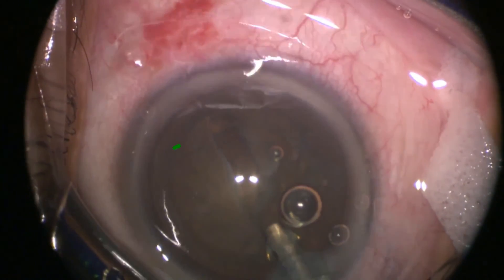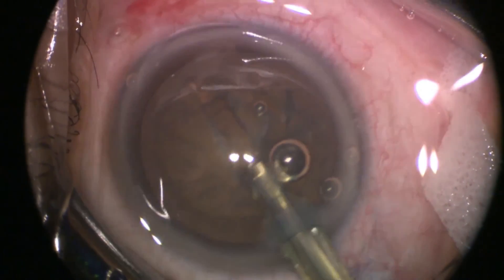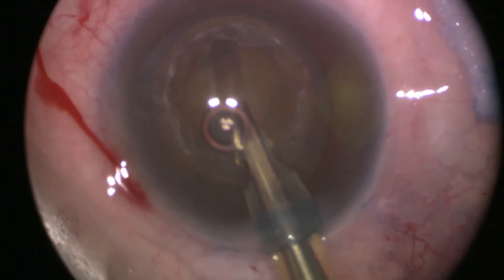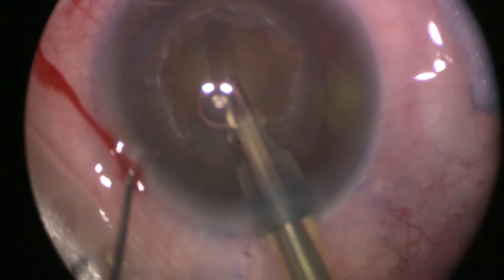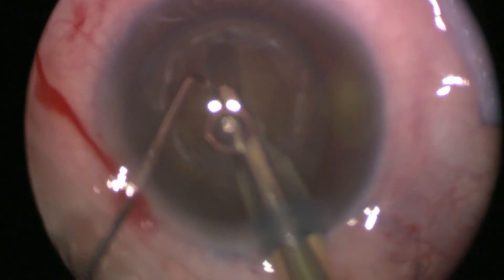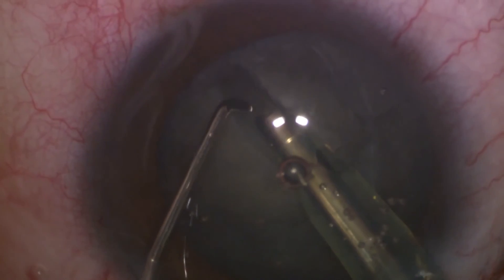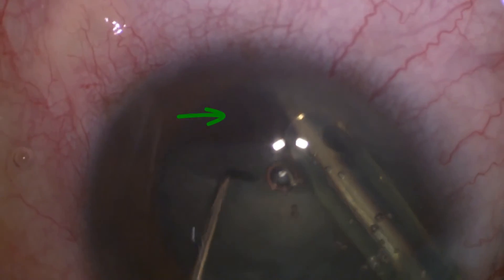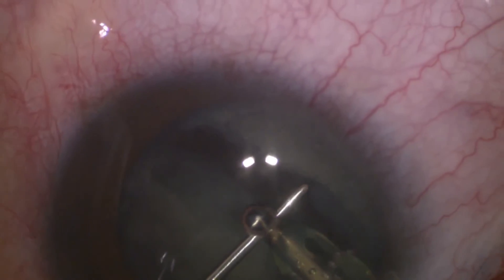As you are proceeding deeper, you will notice that the red reflex is getting brighter, and this will help you in assessing the depth of your groove. If you reach a satisfactory depth, insert a second instrument and attempt to split the lens. Place the phaco probe and the second instrument in the deepest part of your groove and start moving them to the sides gently. As you spread the two heminuclei apart, you will see the glow of the red reflex from behind. At this moment, continue until you are sure that you have achieved total splitting along the whole length of the groove.